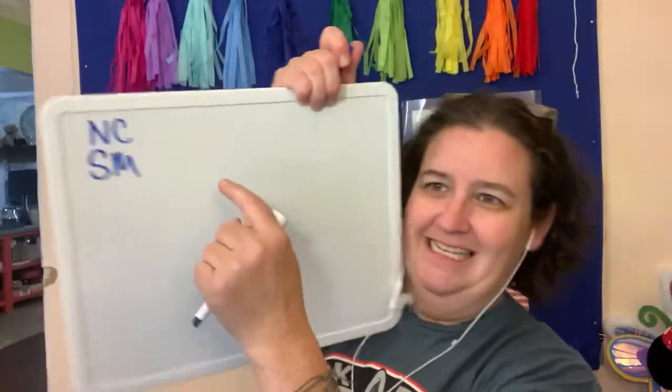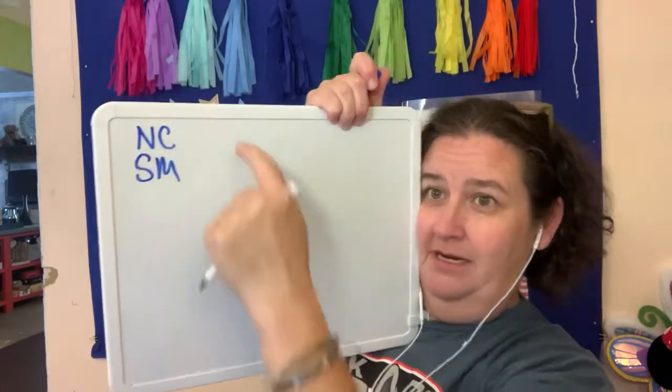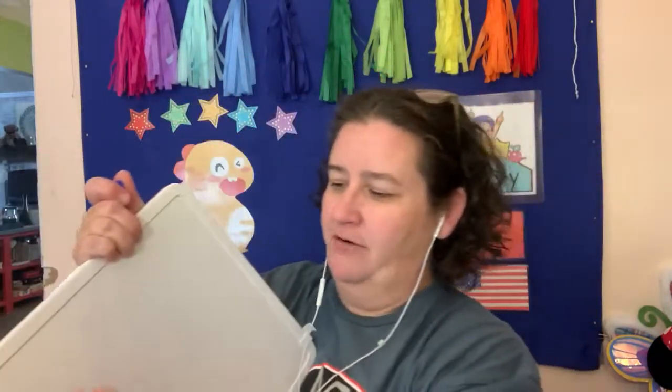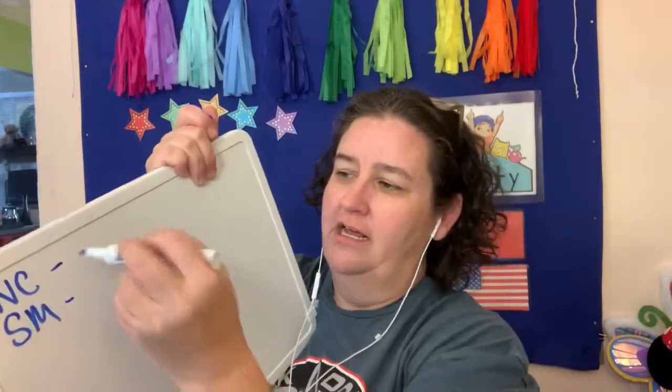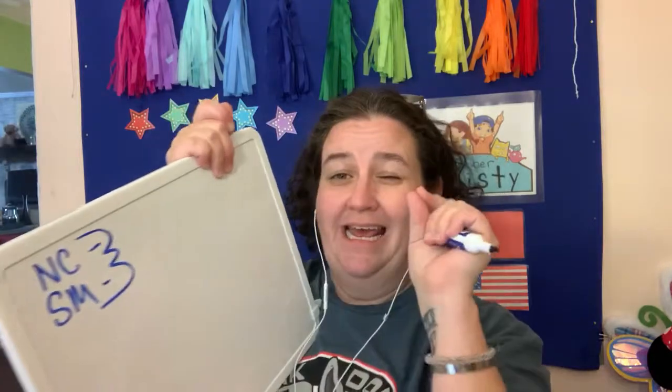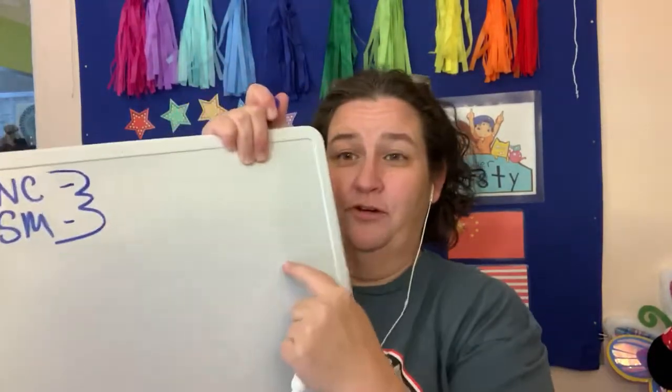We are going to do a little math. So, with the nasal cannula and the simple mask. This nasal cannula, NC and SM, nasal cannula, simple mask. I know it's backwards, I'm sorry, I don't know what to tell you. I'll redo the math in lab. All right, these two devices, we can estimate how much FiO2 a patient's on based on their flow.